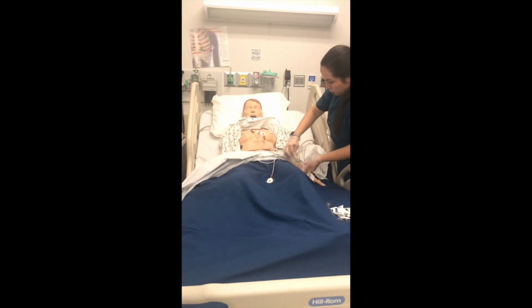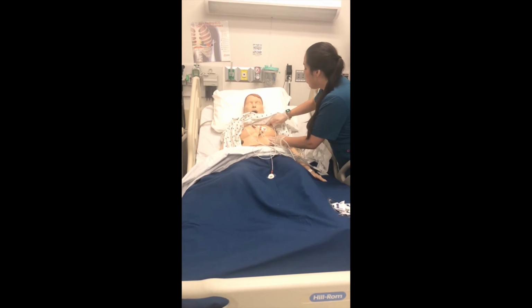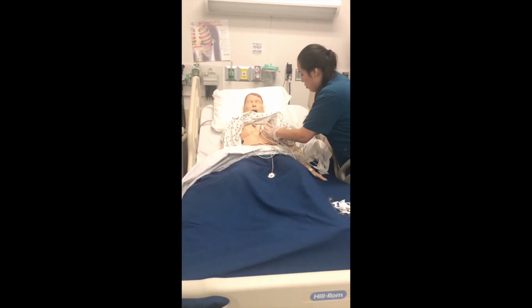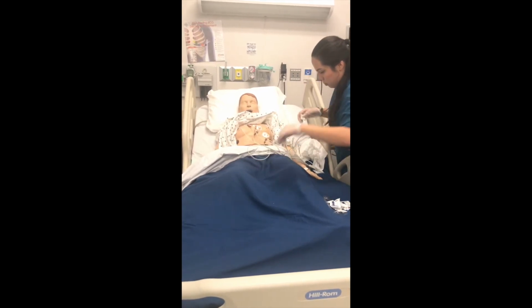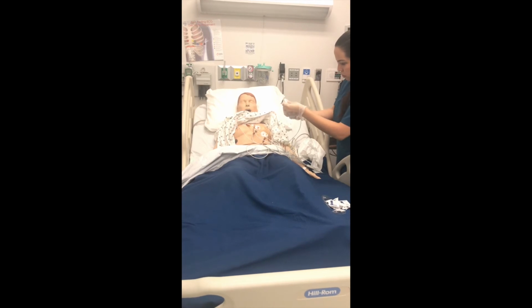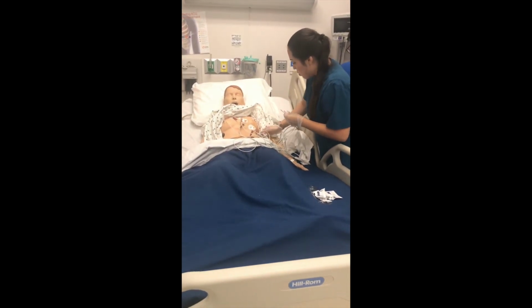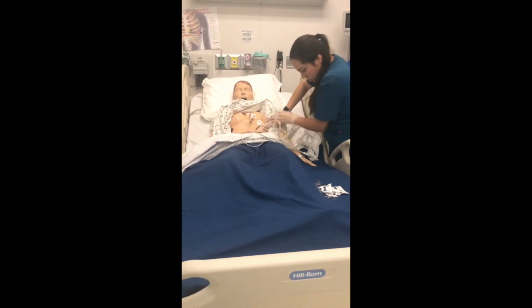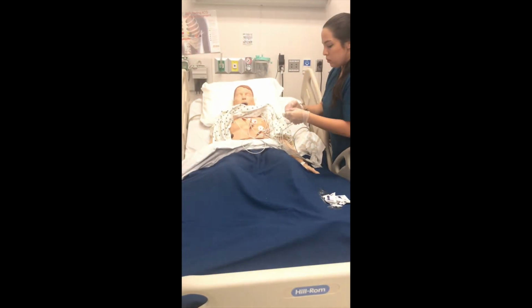V4, the 5th intercostal space at the left mid-clavicular line. V5, the 5th intercostal space at the anterior axillary line. And V6, the fifth intercostal space, the left mid-axillary line.